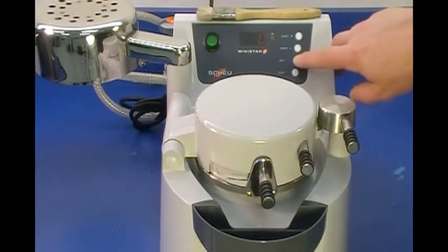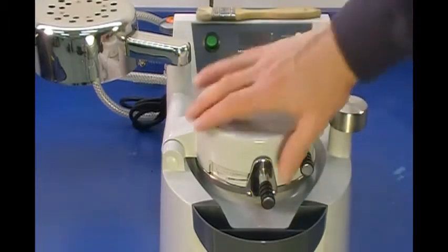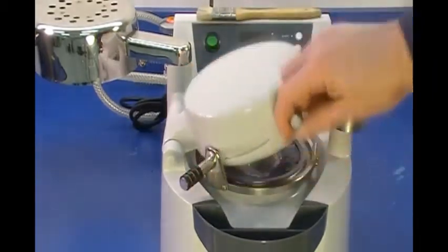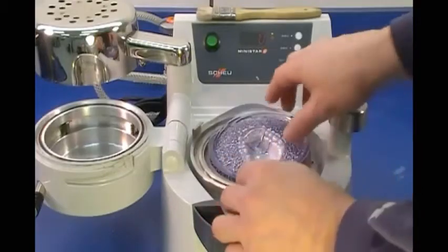At the end of the cooling and curing cycle, evacuate the pressure from the chamber. Unlock the chamber and clamped material. Swing open the chamber and remove formed material and model from the pellet cup.